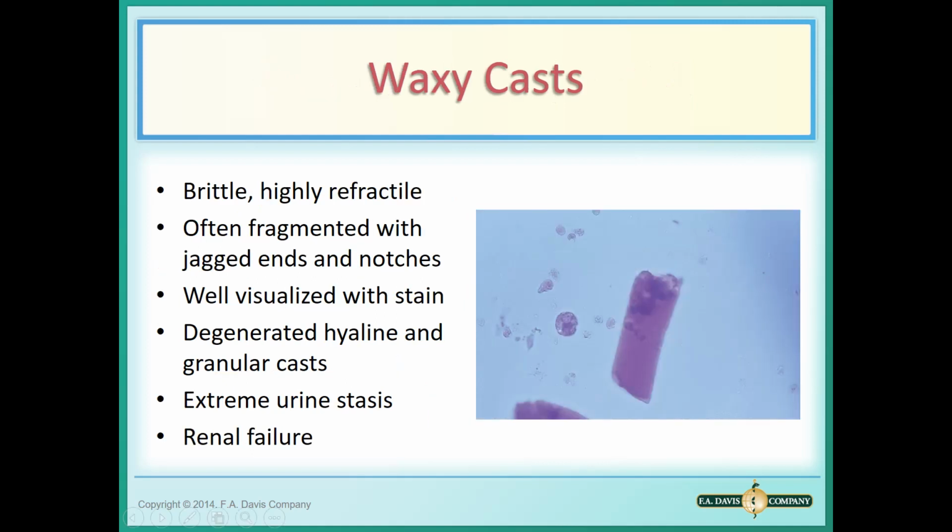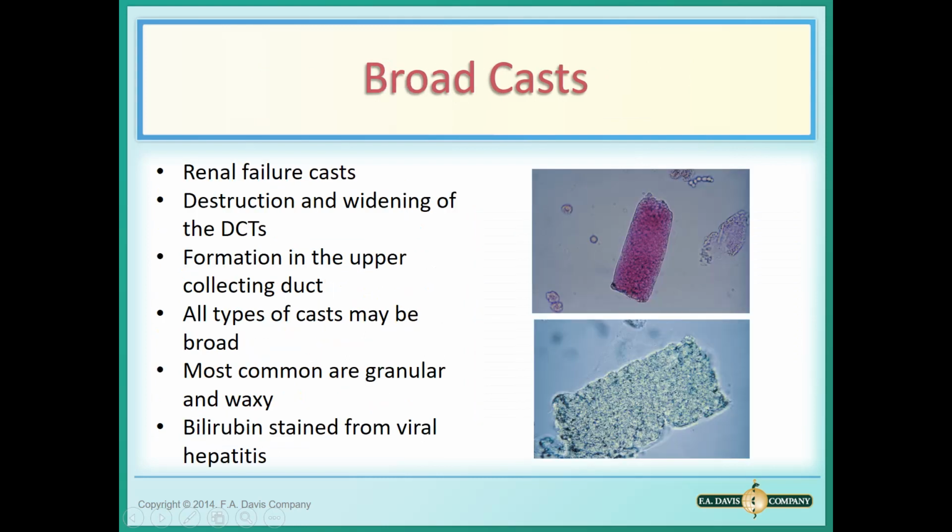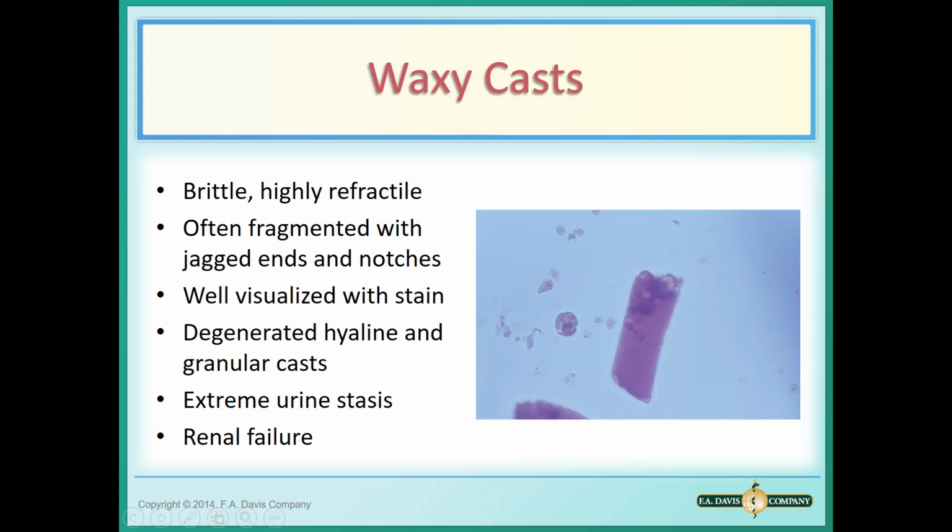This is not the best waxy cast I've ever seen. Wish I had one more. You notice that it looks waxy. It's very refractile. A lot of times you see the wax, just like you can imagine wax starting to dry out if you left it on a counter and it starts to get cracks in it. Waxy casts often get jagged edges or breaks into the wax. They call them notches. And I'll see if I can find some more pictures of it. I'm sure we'll come across some more.